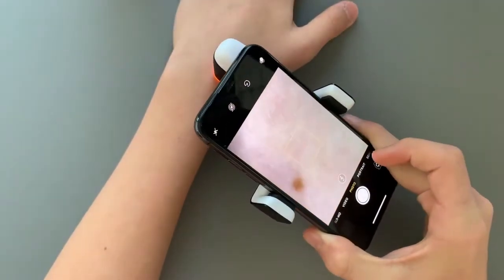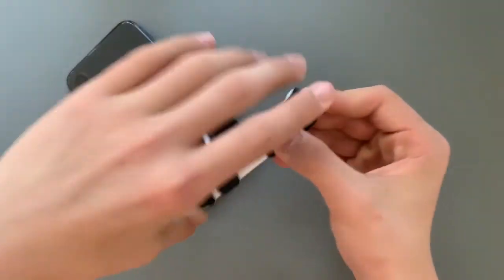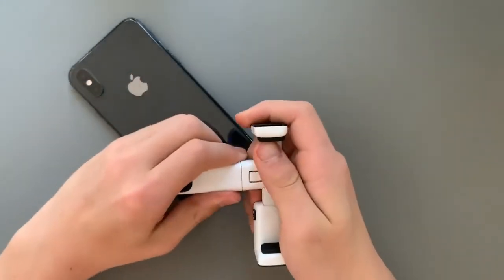Push the little power button to turn on the light, place it right on your skin lesion or scalp, and take a picture. Since Hood is compatible with a variety of apps, please follow your healthcare provider's recommendation.